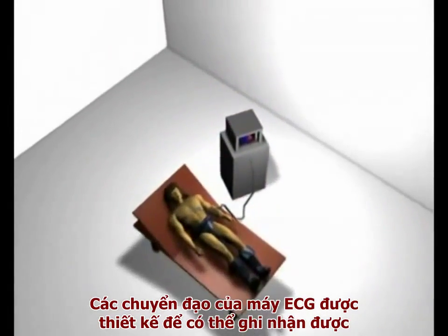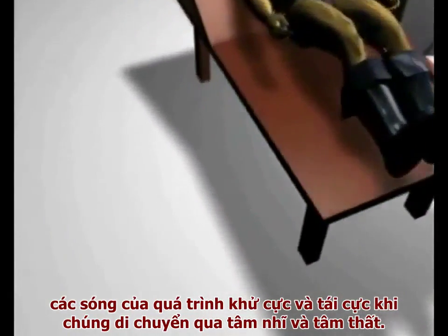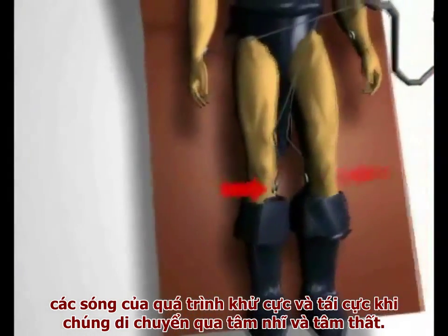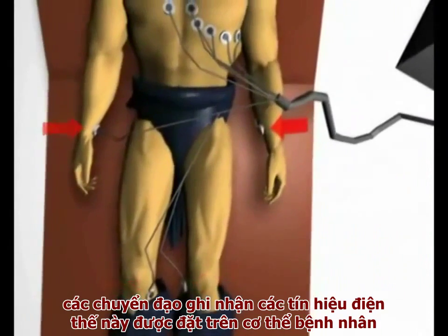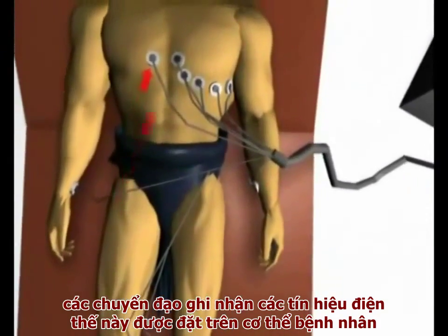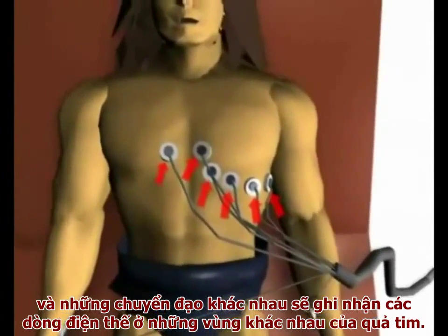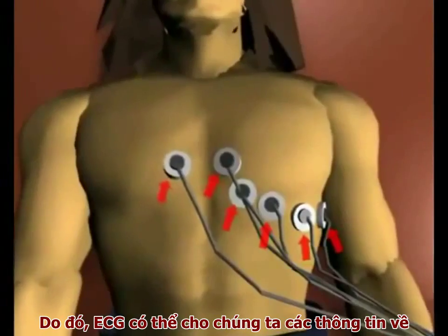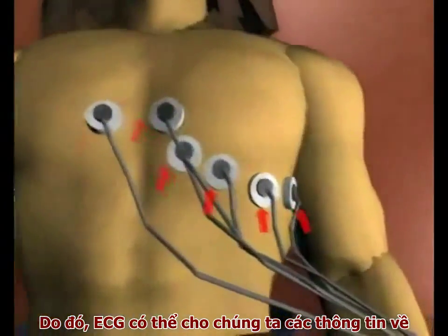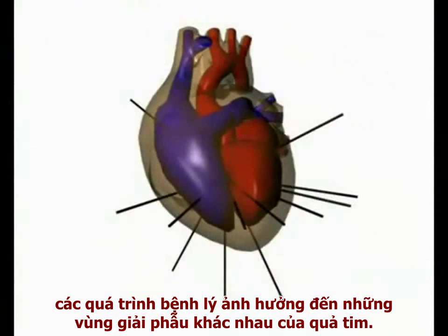The leads of the ECG machine detect the movement of the cardiac depolarization and repolarization waves as they spread through the atria and ventricles. Leads capable of detecting electrical signal are placed on the patient's body, and the different lead positions record the flow of current through the heart from different perspectives. In this way, the ECG recording can give us information about disease processes affecting different anatomical regions of the organ.